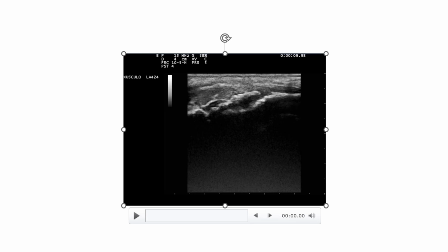The echo image moves from the patella to the patellar tendon to the tibial tuberosity, and an irregular image of the bone surface can be observed on the tibial tuberosity.